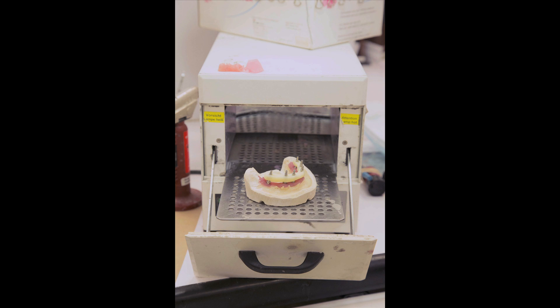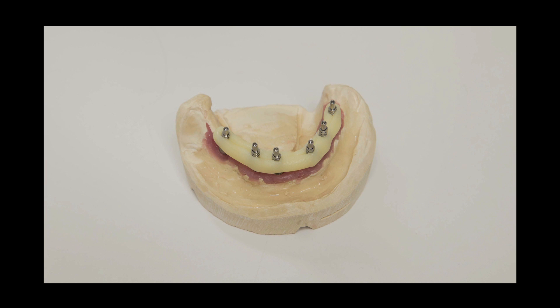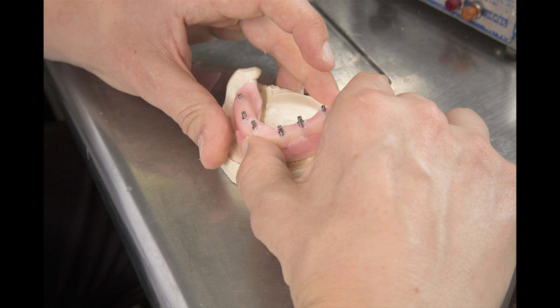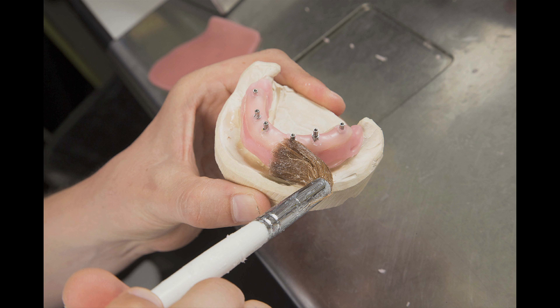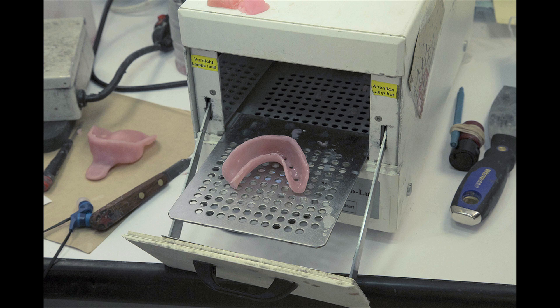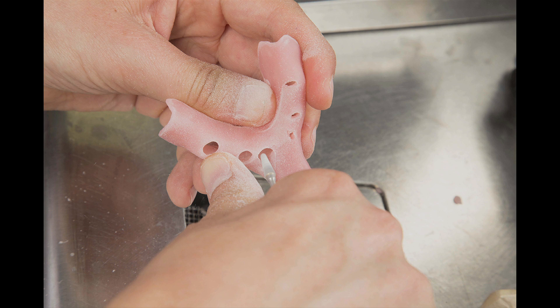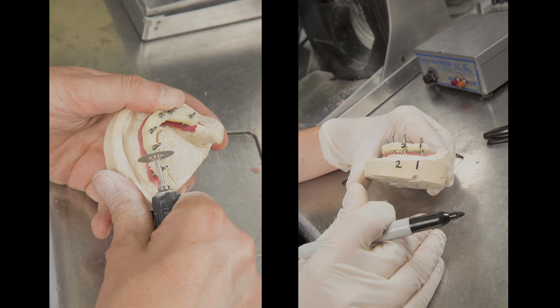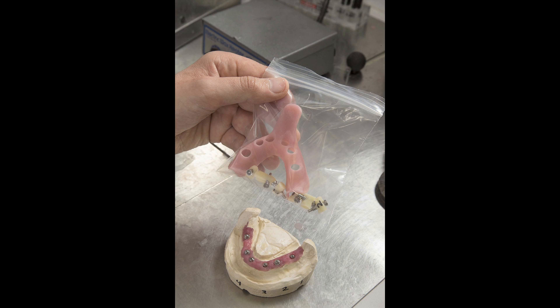The implant verification jig is light-cured and remains in place on the model during the next step: fabrication of the custom tray. The process for creating a custom tray begins with forming warm soft wax over the implant verification jig and onto the model. Additional wax is added to remove any undercuts and petroleum jelly is applied to the model to facilitate easy removal of the custom tray. The custom tray is light-cured and while the wax is still warm, the tray is removed from the model, inverted, and cured again. Holes are opened in the tray at the position of each titanium cylinder of the verification jig. The edges of the custom tray are trimmed and its fit over the model is verified. The implant verification jig is then sectioned and numbered and forwarded to the doctor along with the custom tray and the wax setup. If the decision was made to utilize multi-unit abutments, they will also be delivered to the doctor at this time.